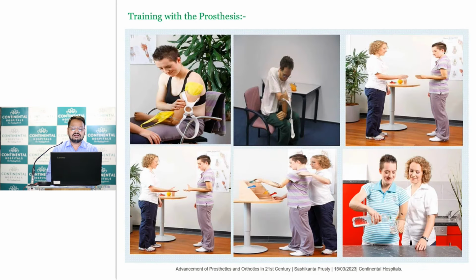Then coming into the training with prosthesis, because this is very important. Once we put a prosthesis, they should also know how to control the prosthesis. When talking about upper extremities, these are some of the ideal activities or ideal devices.